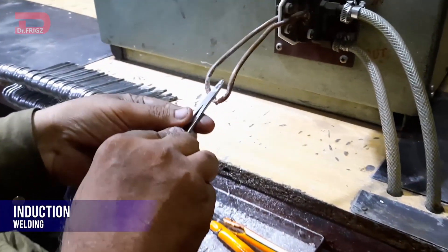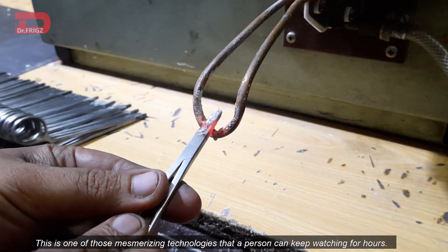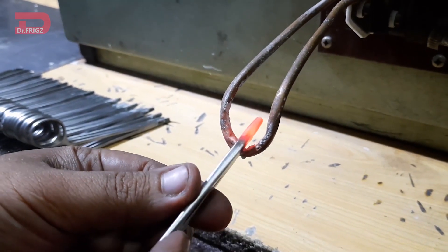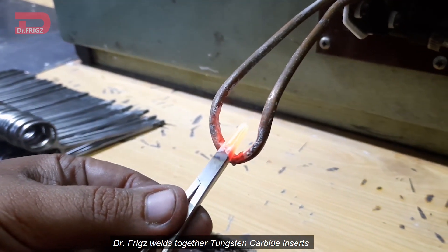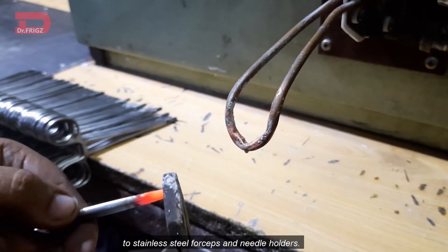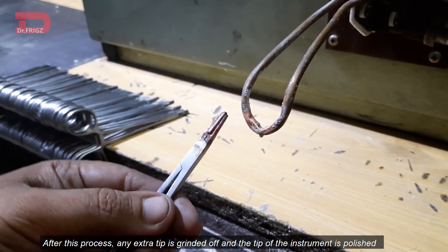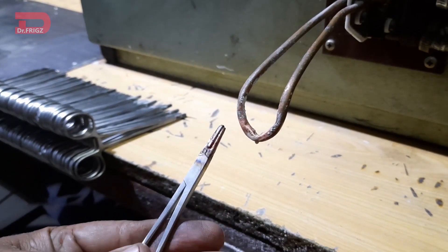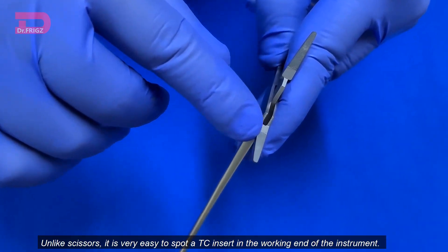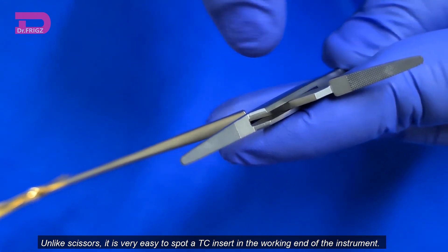Induction welding. This is one of those mesmerizing technologies that a person can keep watching for hours. Through this electromagnetic induction process, Dr. Friggs welds together tungsten carbide inserts to stainless steel surgical forceps and needle holders. After this process, any extra tip is grinded off and the tip of the instrument is polished to get an even surface for the working end of the instrument. Unlike scissors, it is very easy to spot a TC insert in the working end of the instrument.